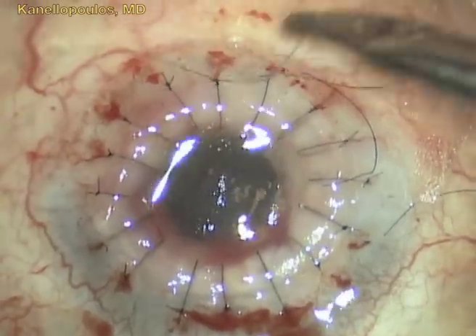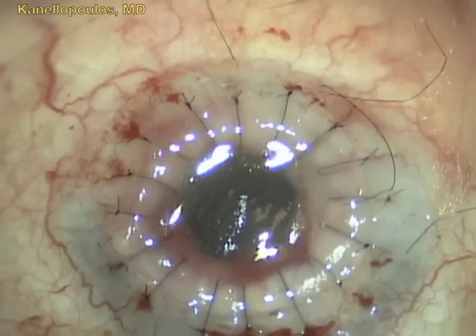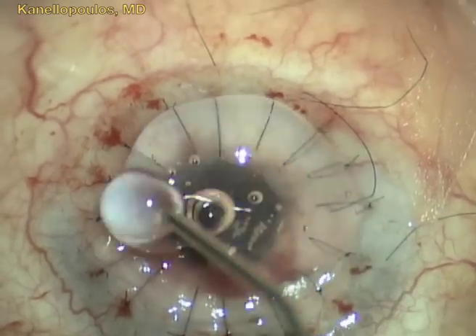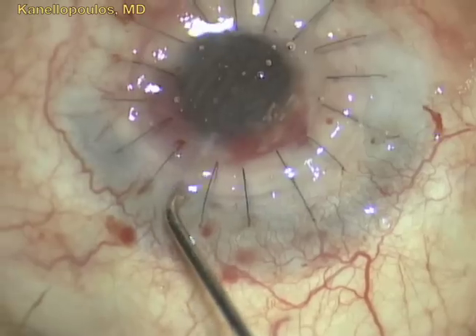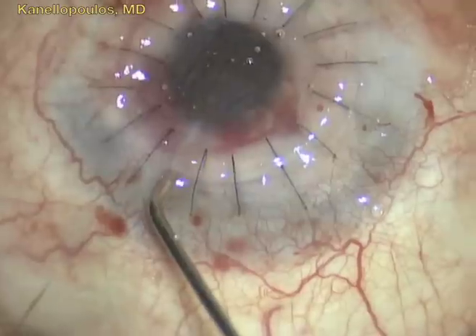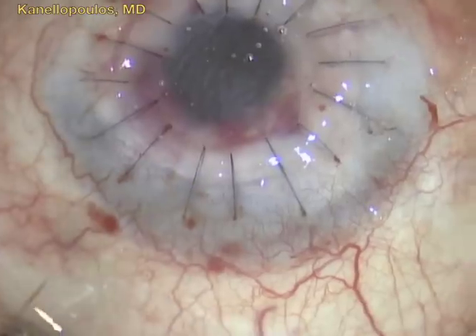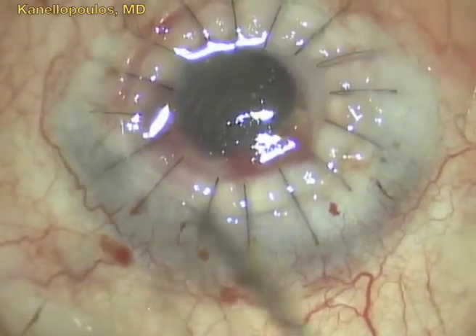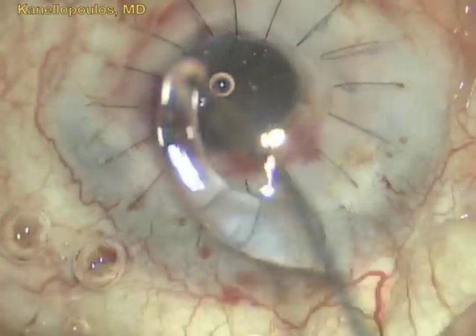Basic keratoplasty technique — we'll trim the sutures and bury the knots in the host bed, otherwise standard. In this particular case, we instilled Vastin and Kenalog to reduce the chance of inflammation because of the vigorous iris manipulation.